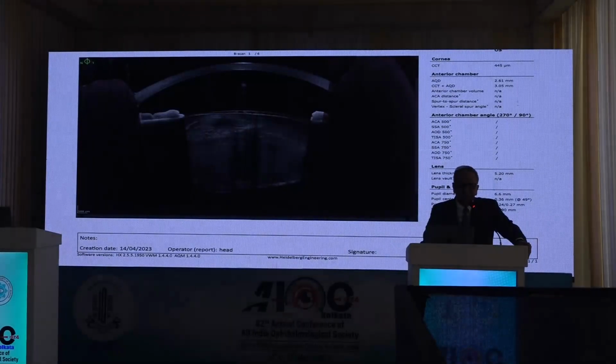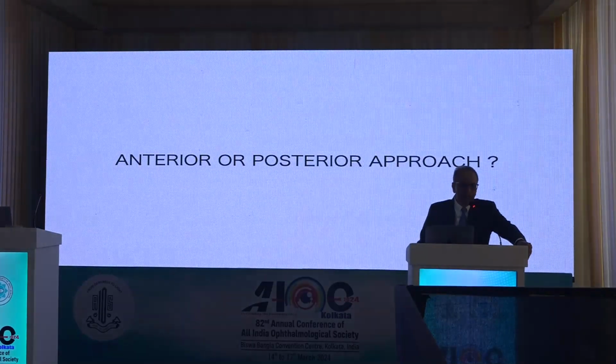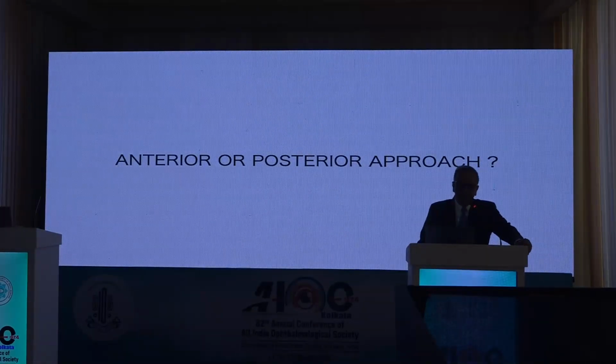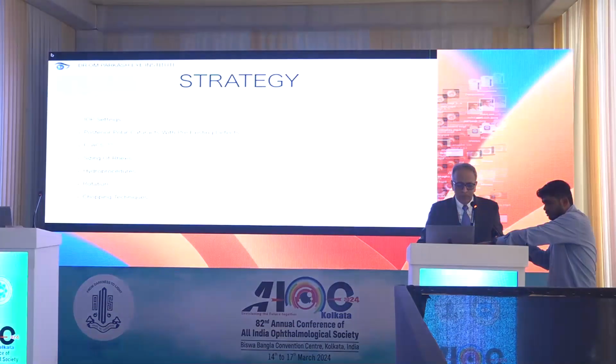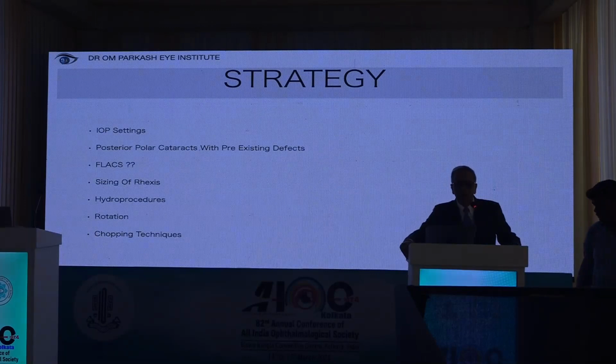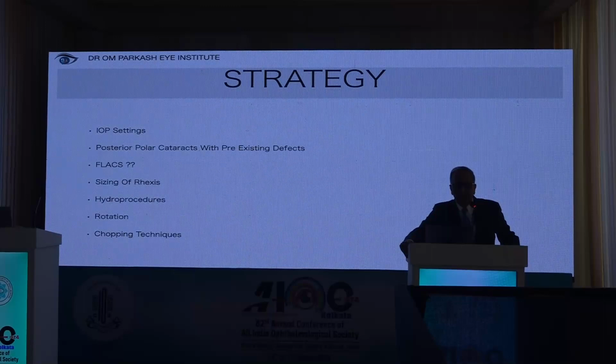So we did a pre-operative OCT and realized that there was a PCR. Now the question was whether we should go in for an anterior approach or a posterior approach. Well, with the new machines and new fluidics, we went in for the anterior approach. So the strategy was to use low IOP settings as has been propagated by Bob Osher and Abhay Vasavada.